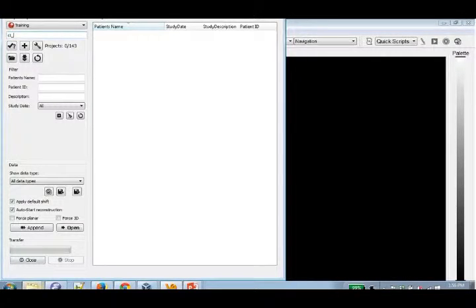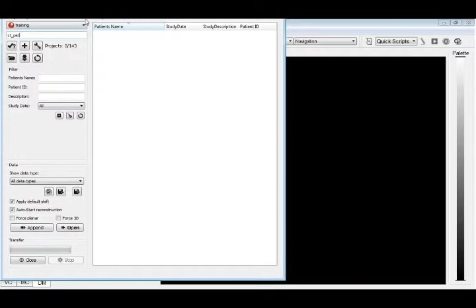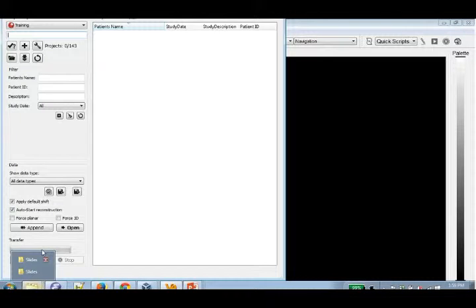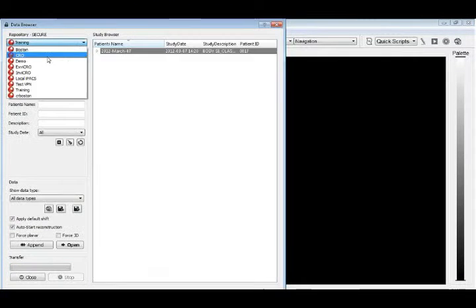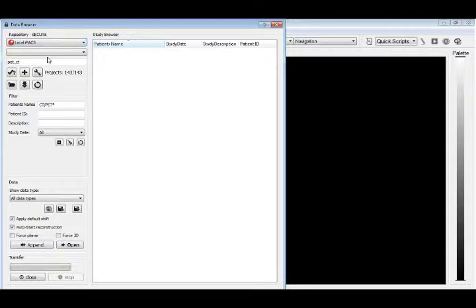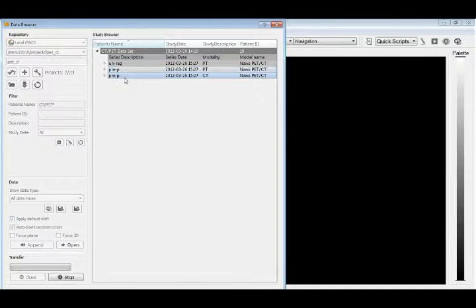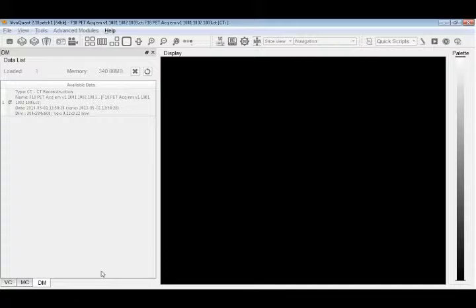They're powerful query mechanisms. So they selected the iPACS. You can actually have most iPACS configured in your system. And so you choose one, because, for instance, on our iPACS systems, we can have thousands of projects. Actually, it's a small project filter that allows you to drill it down to just the project you're looking for. And then you can download data. So that was actually downloaded from the German servers. Yeah, it was the training iPACS, not the local one.